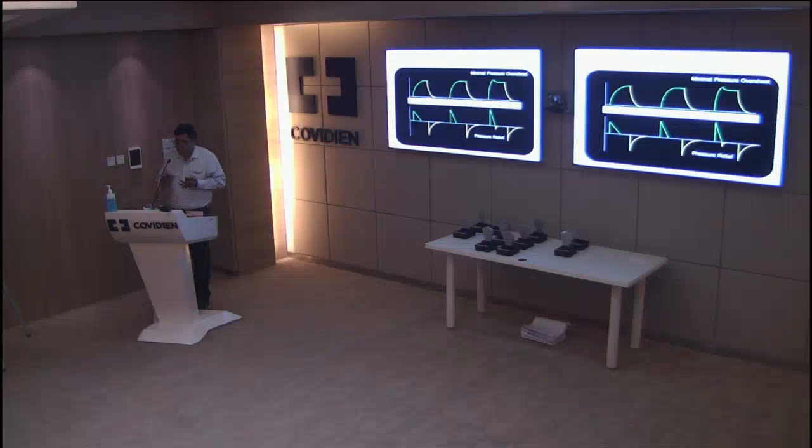The only other problem in pressure support, if you keep a rise time that is too fast, because the initial flow is too fast, it will fall to 25% of its peak flow very quickly, because the initial flow is very fast. Therefore, inspiratory time might be too short. So that is another problem you have with too high a rise time in pressure support ventilation. Therefore, that's the other thing you need to take up.